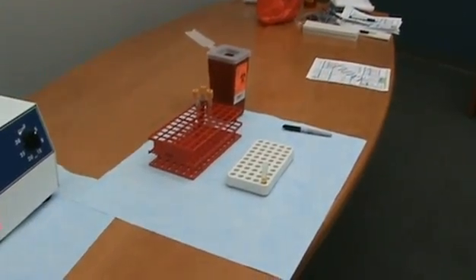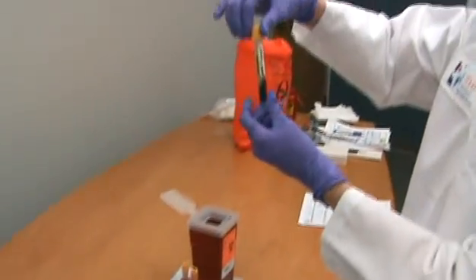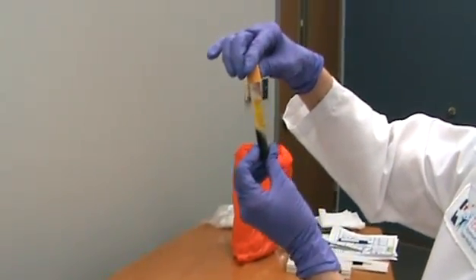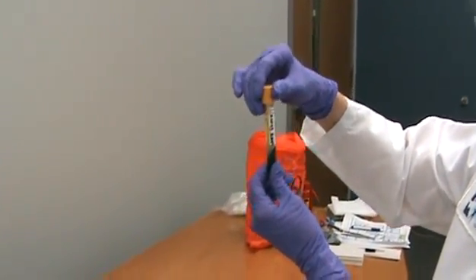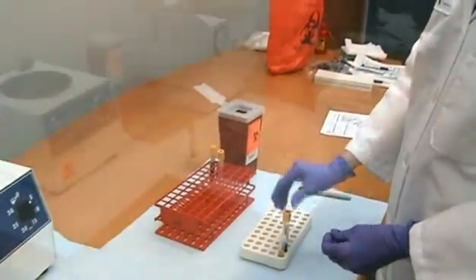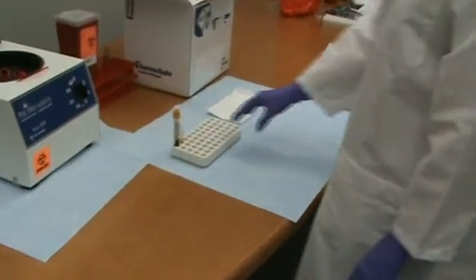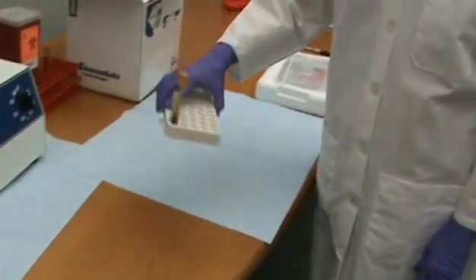If collecting specimens from an SST, the serum does not need to be transferred to a transport container after centrifugation. Please ensure that the fill volume adheres to the recommended instructions contained in the package insert. Place the labeled transport tube or centrifuged SST in a cooler or other cold storage device until ready for shipping.